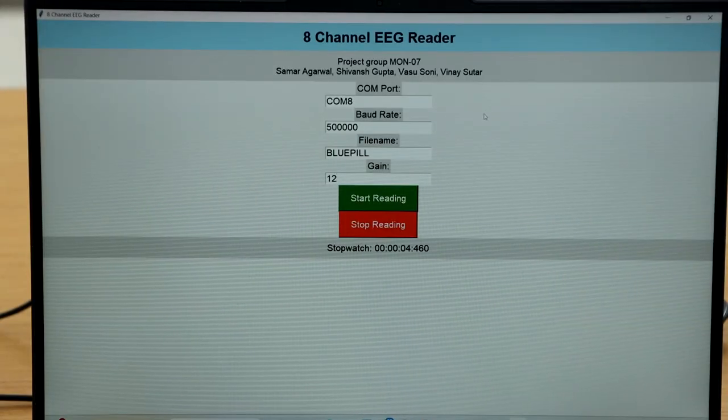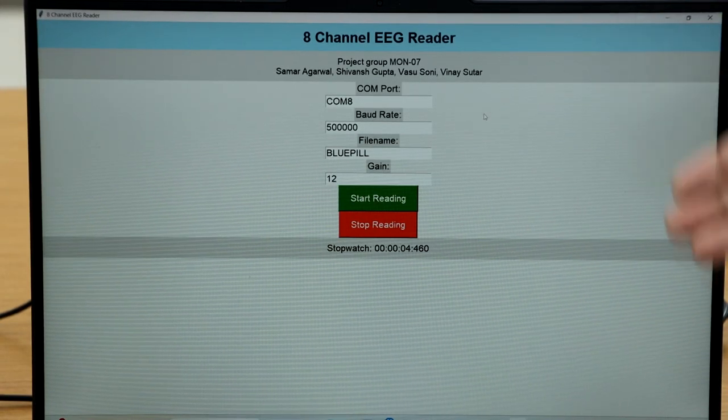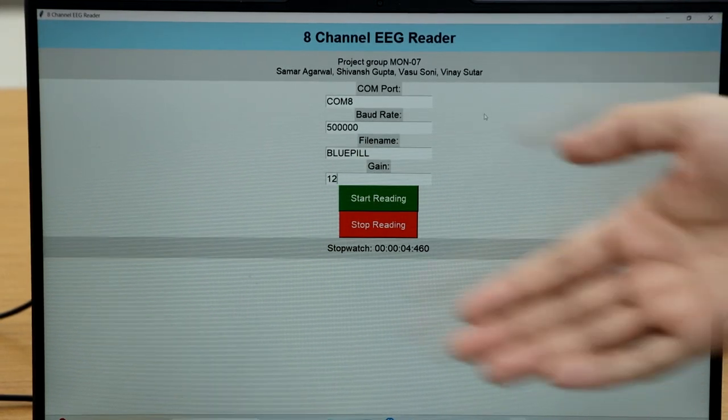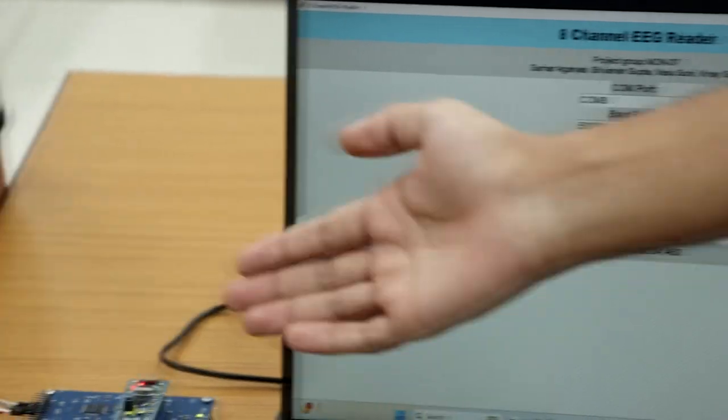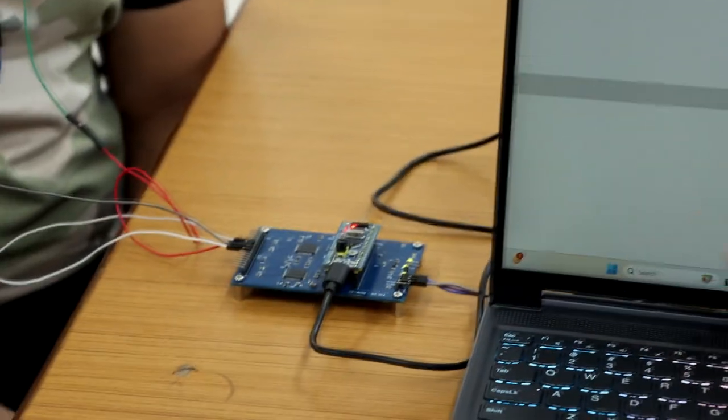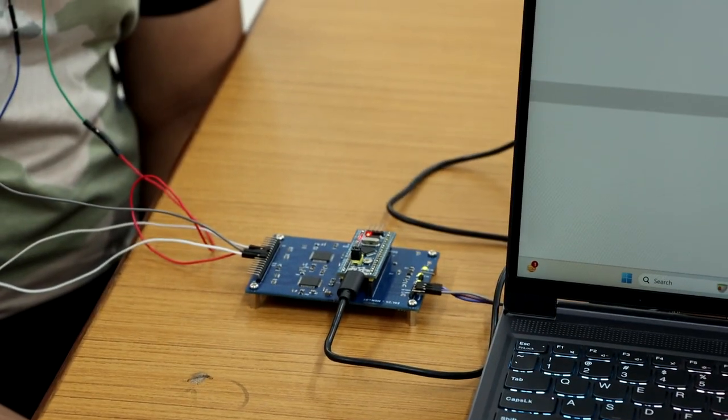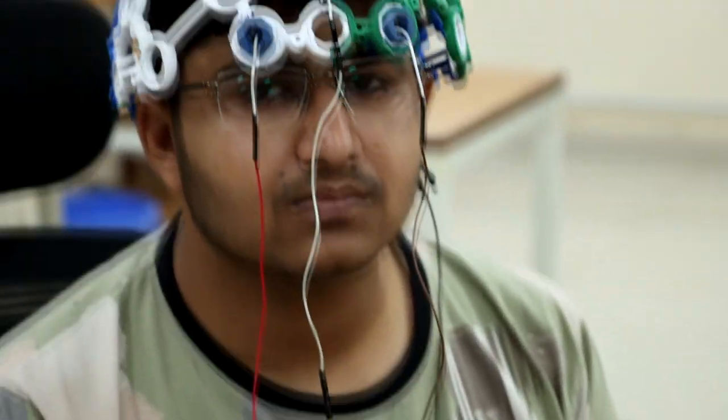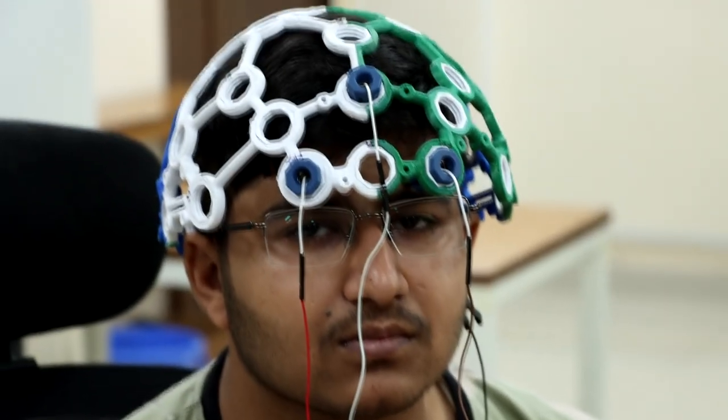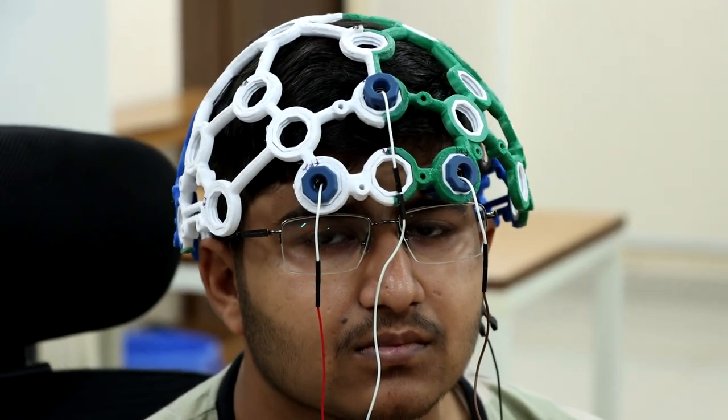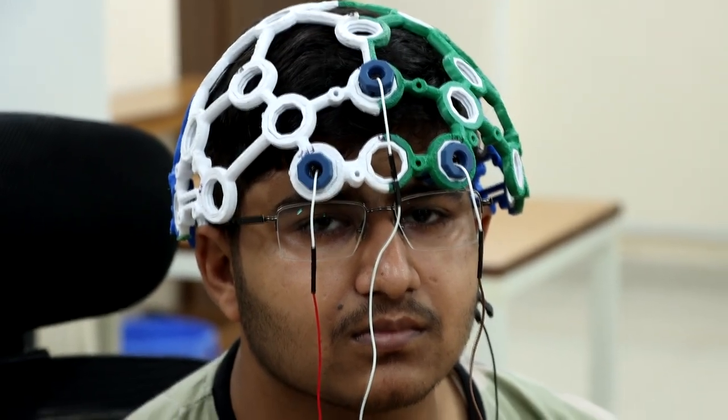This is our GUI. The data is acquired through our PCB and is coming from the 3D printed headset via electrodes which are located at different locations on the brain.